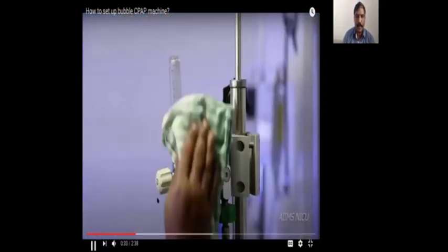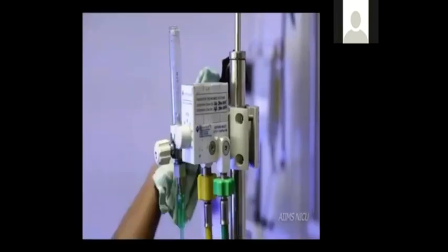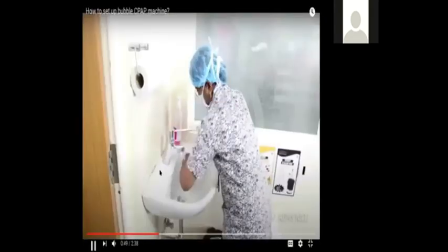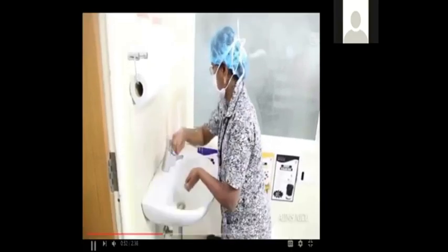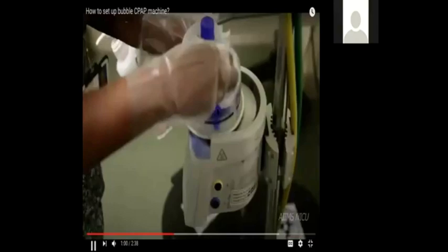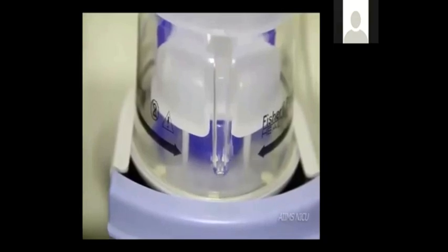Clean the machine with 2% Sidex or any other approved disinfectant. Clean the heater wire and temperature probe with a clean and soft cloth and sterilium. Connect the machine to compressed source of air and oxygen. After washing hands and wearing clean gloves, open the disposable CPAP circuit. Fix the water chamber onto the servo humidifier and fill it with distilled water. Use the autofill option of fixing the distilled water bottle to a stand for filling the water chamber.